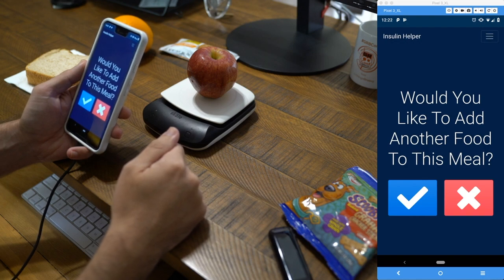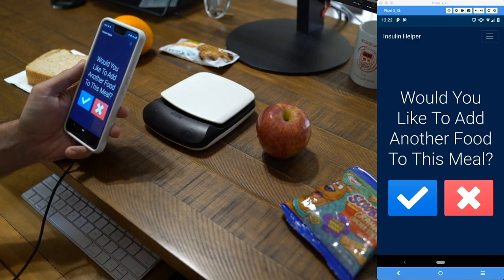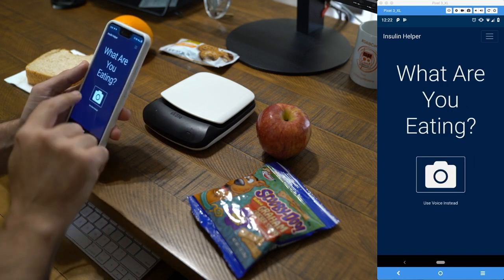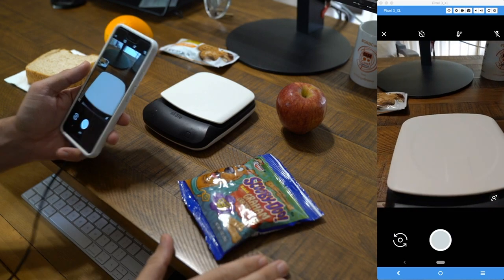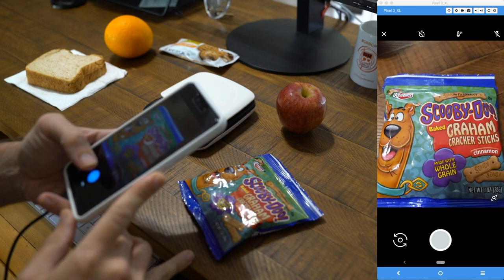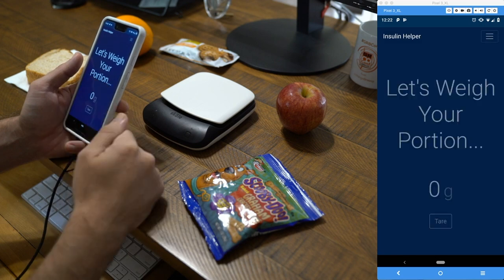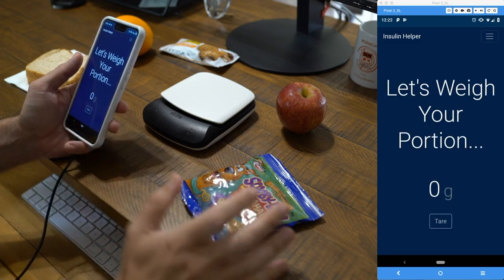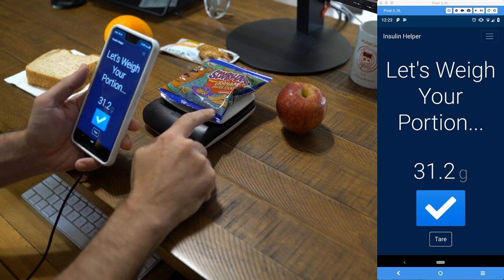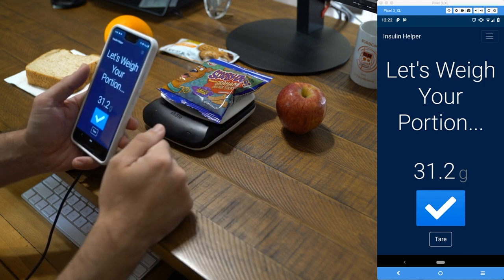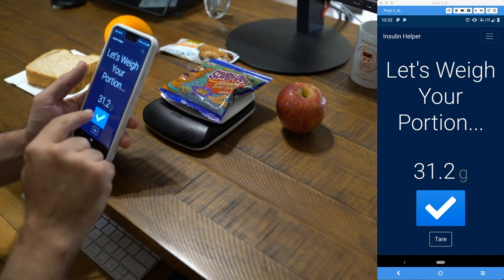It asks if we'd like to add another food, because we're usually eating more than one thing. We say yes and take another picture — this time of some Scooby Snacks, which will be more difficult to identify. We upload that picture and the application tries to identify any text it can find inside the image. We weigh them at 31 grams. It's a 28-gram container, so we'd ideally weigh them directly on the scale for accuracy, but 31 grams is close enough.